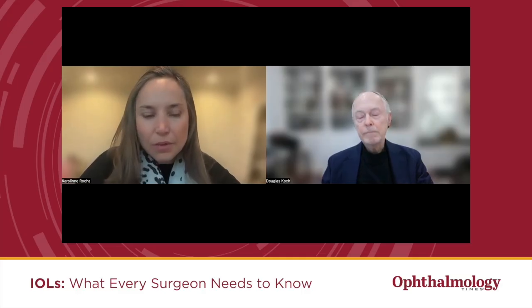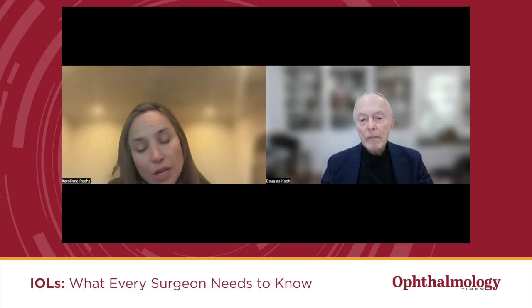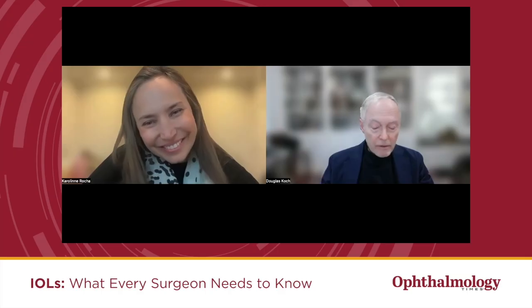With irregular corneas, I may want to do an aberration-free lens. Someone that had hyperopic LASIK, you can match depending on the topography. Although those lenses are very forgiving, actually. I think we definitely need more studies in those different categories. But I still avoid them in someone, for example, with keratoconus and a lot of coma, then I probably will do just an aberration-free lens. Yeah, I do the same.